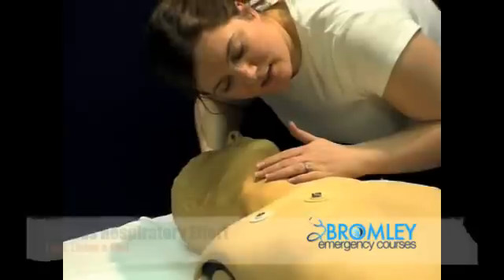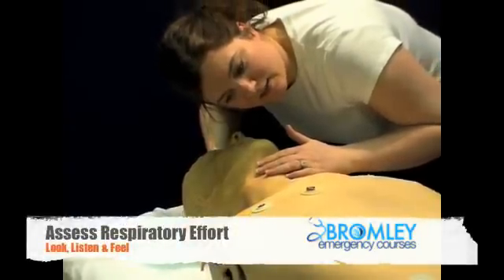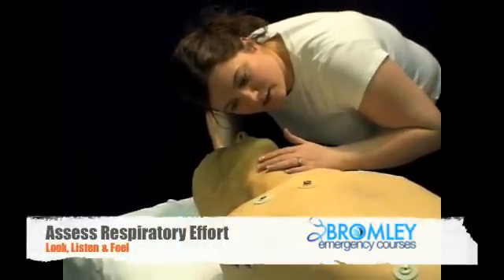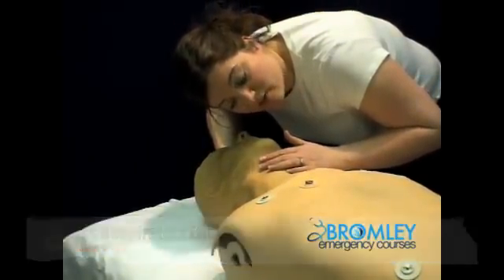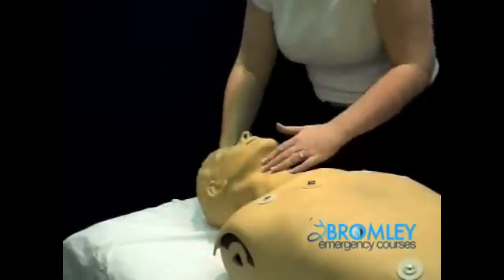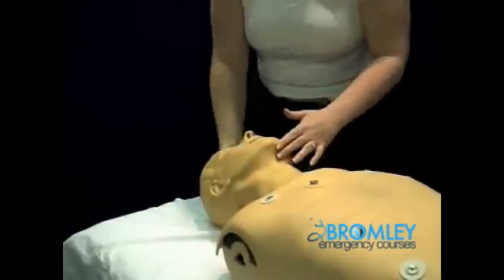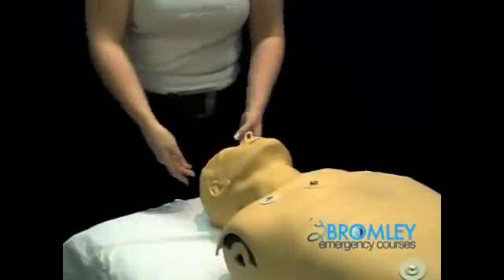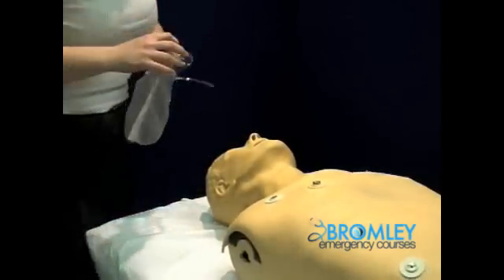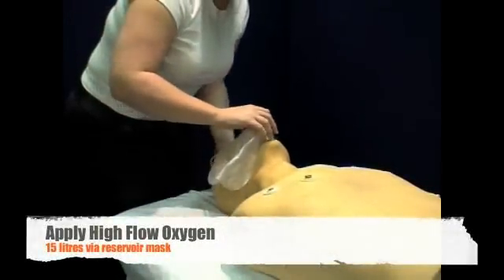I am looking, listening and feeling for ten seconds to see if there is any sign of breathing. And there are some signs of breathing. So I am going to keep the airway open and apply some supplemental oxygen.